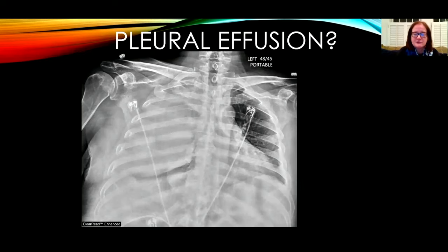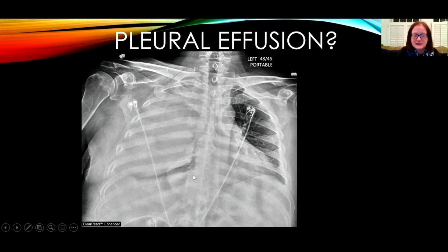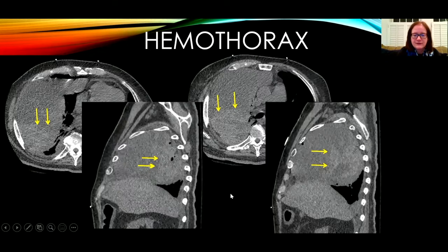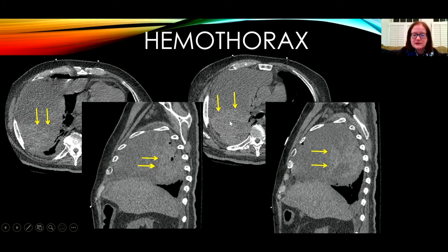This is a patient on anticoagulation treatment who became acutely short of breath, and chest radiograph shows a large right pleural effusion. One thing to notice is that this is quite dense, with increased attenuation. A non-contrast CT shows the large right pleural effusion, and the axial and sagittal images show dependent layering of high-attenuation hematocrit in this patient with hemothorax. CT with contrast can be used to look for extravasation.